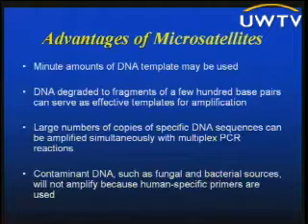Additional advantages is that you need very little amounts of DNA. And this is a huge advantage when you're looking at cell subsets, because oftentimes you can get few nanograms of DNA out of an isolated cell subset. And that allows us to still question what a percent of donor in a mix would be. The DNA can be degraded. It doesn't have to be intact. It can be only a few 100 nucleotides in length and will still be an effective template.